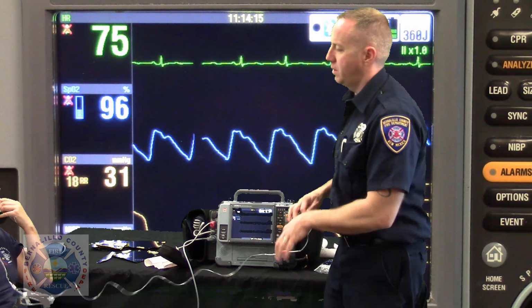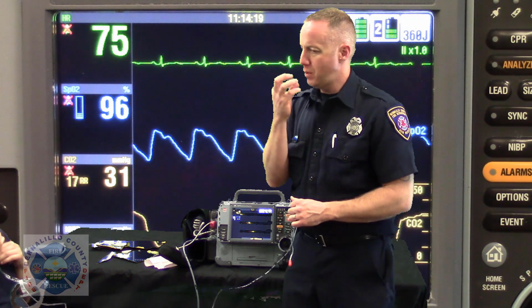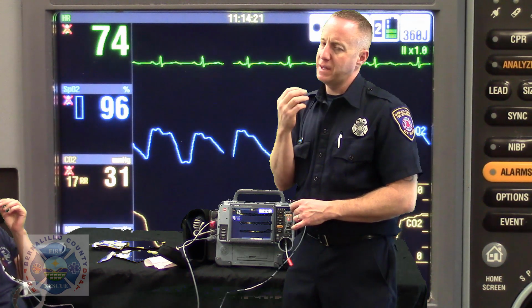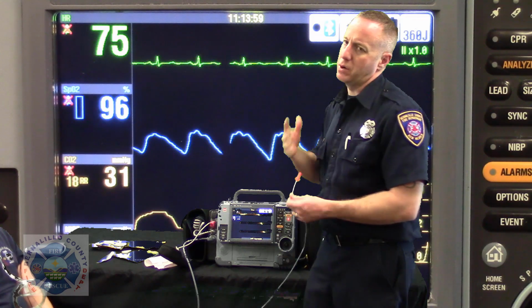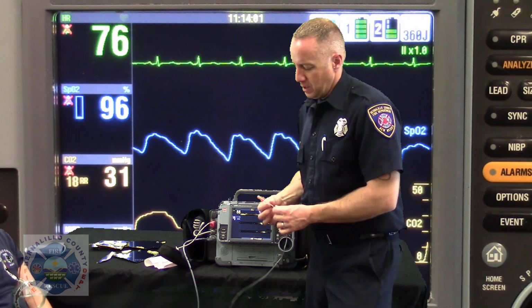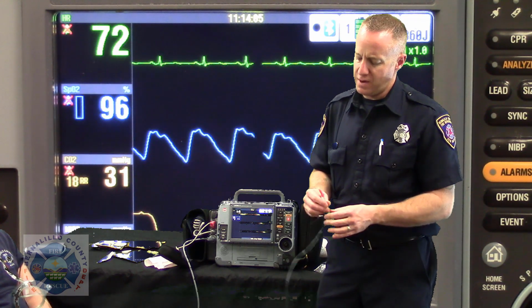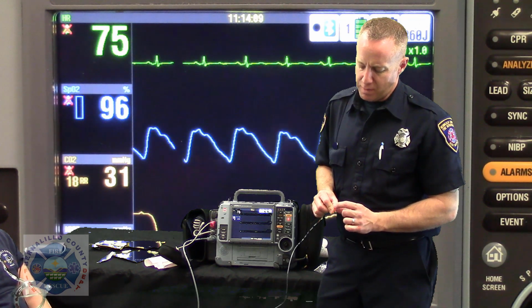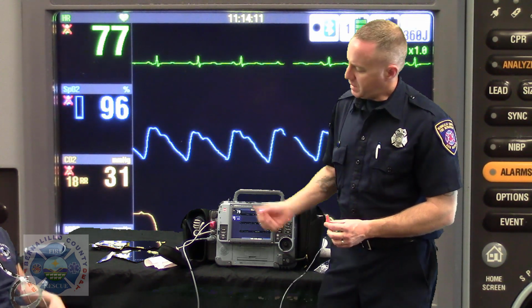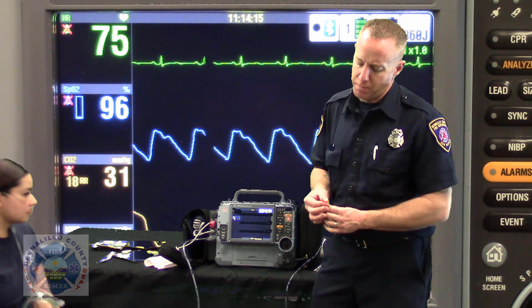We'll have the patient apply that correctly, the oral sampling cup towards the mouth in case they're mouth breathing, and the nasal prongs in the nose in case they're nose breathing, or a combination of the two. You'll notice at the distal end of the sampling cannula, you have an electrical connection point here. This little metal ring on the end, when it's inserted into the monitor, turns on the end-tidal mode.